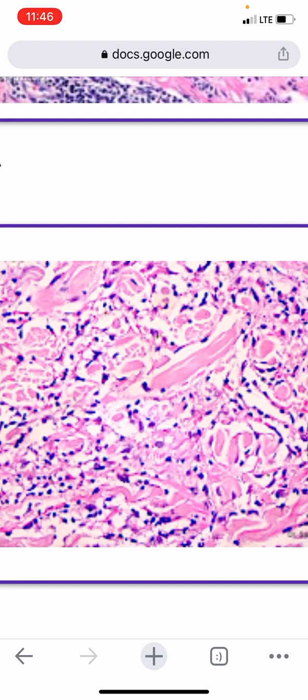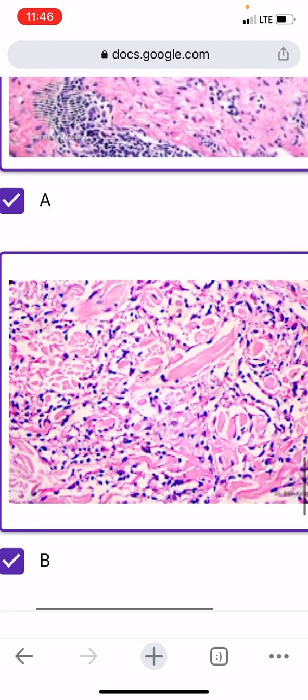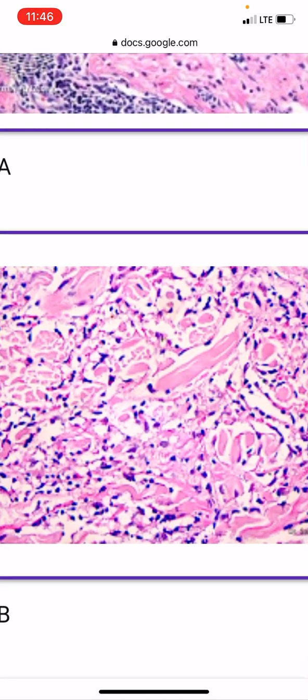Perhaps in the next quiz, I'll put up a slide of what actually constitutes a granuloma, and it is sometimes difficult to diagnose a granuloma because not all granulomas are classical. What actually constitutes a granuloma, is the presence of just a few histiocytes enough to call something a granuloma? We shall discuss that maybe in the next few quizzes. So this is the interstitial variant of granuloma annulare.